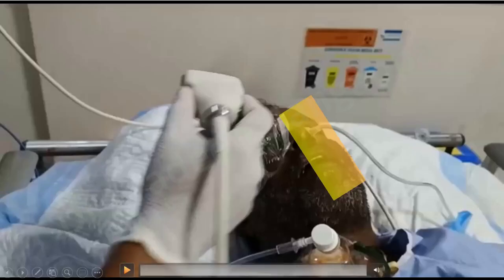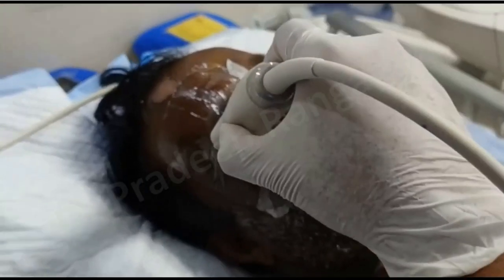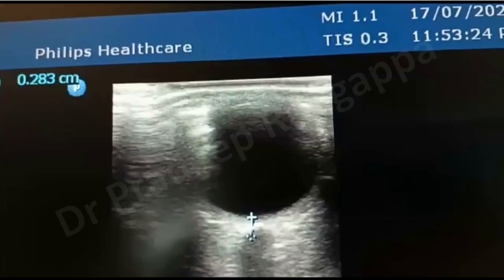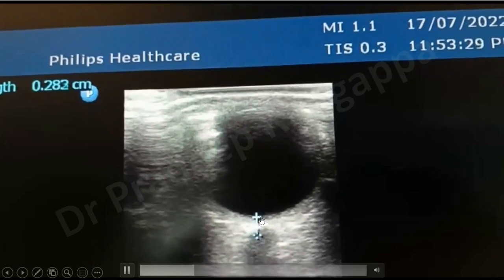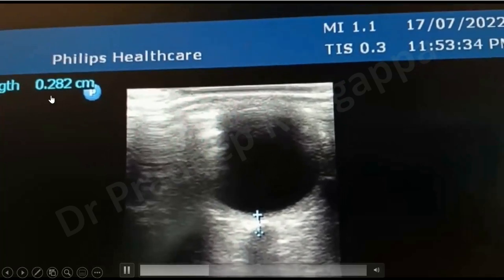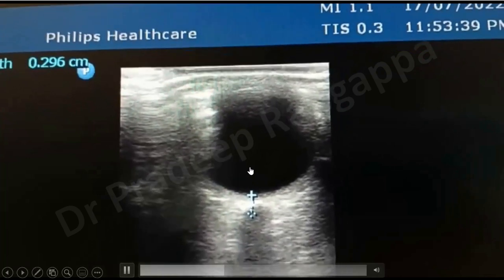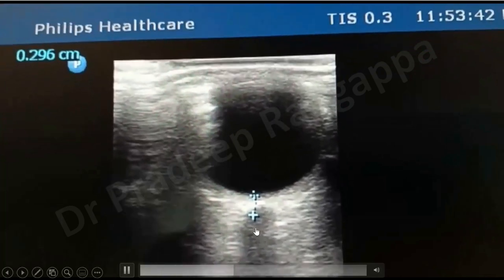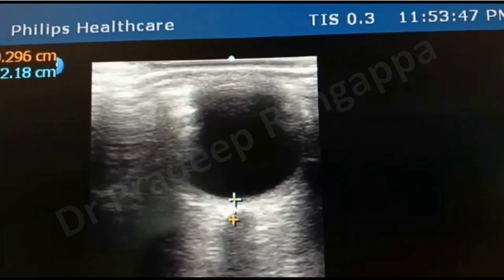Here is a video taken in our ICU. We have put a Tegaderm and the patient is masked. The probe is kept in a transverse position on the upper eyelid. This is a traumatic brain injury patient on tracheostomy — ICP is not high and the patient is stable. You very clearly see the vitreous humor, and from the origin of the optic disc we are taking three millimeters — you can see approximately 2.97 on the calipers.